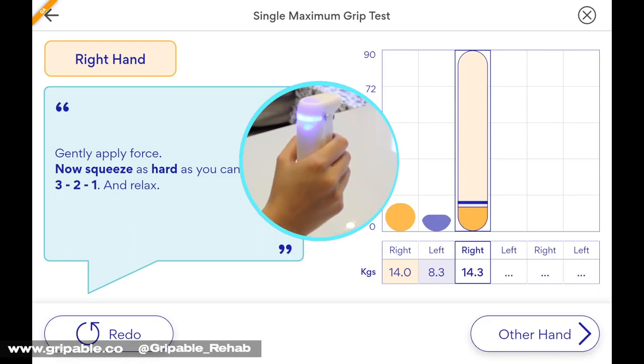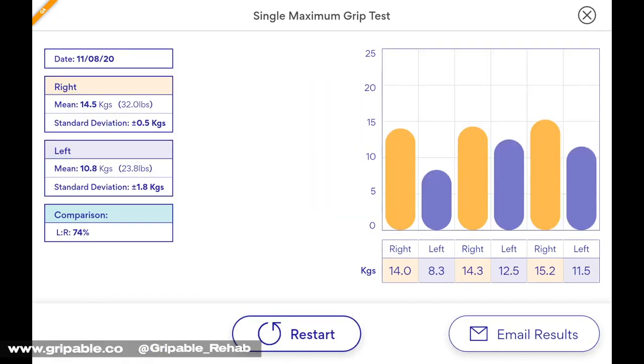By following standardised set-up and procedural instructions, reliability will be enhanced. Email the data for inclusion in patient records.